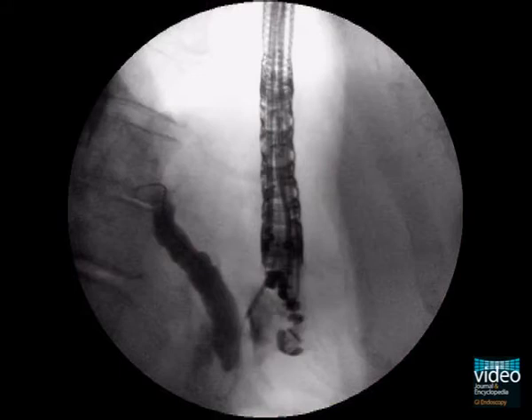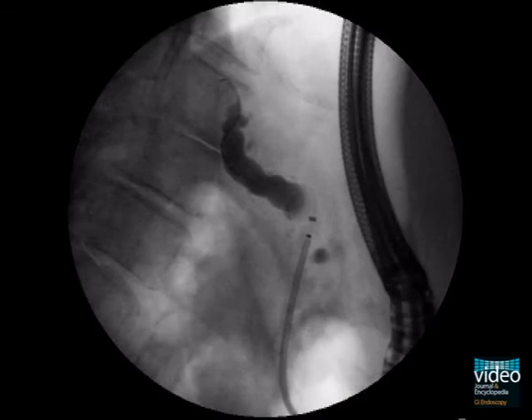Cauterization should be repeated two or three times to facilitate insertion of the dilatation balloon or the stent. The great advantage of the ring knife is the optimal depiction of the cauterization tip in fluoroscopy-based imaging, resulting in a much safer interventional step.